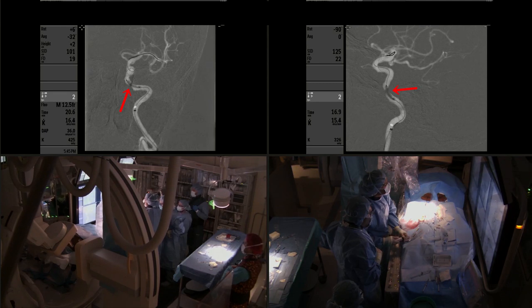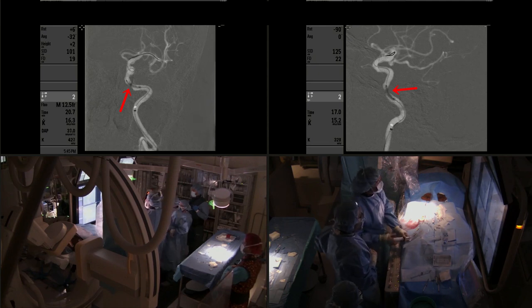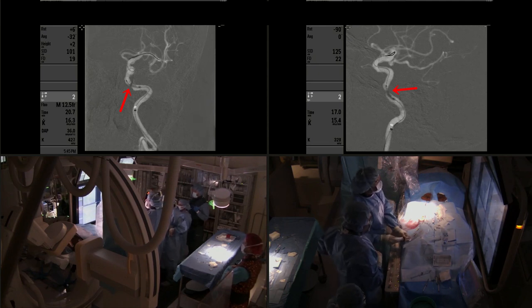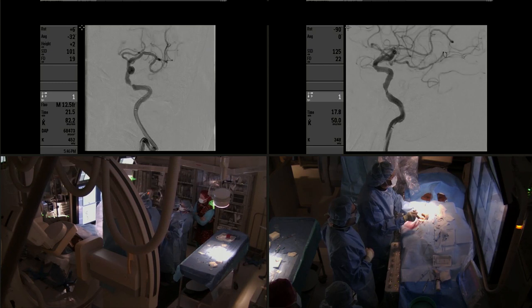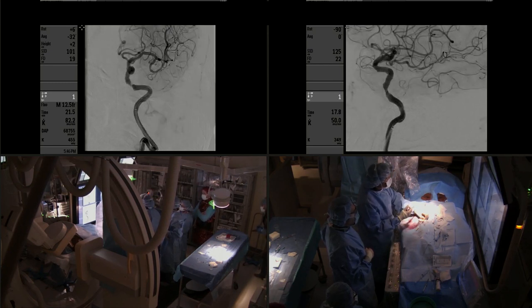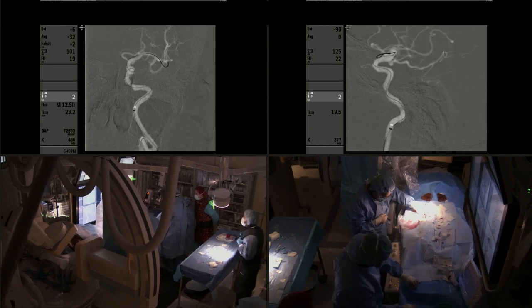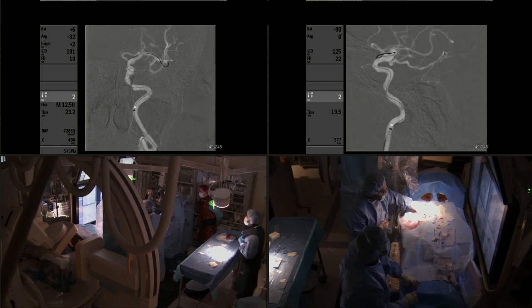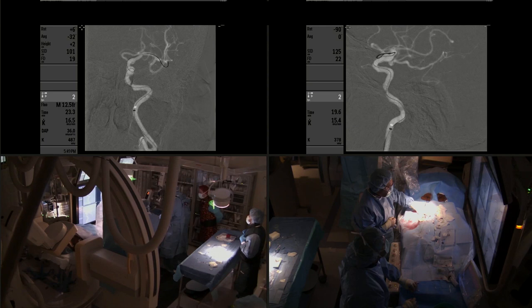We do not do the stent followed by balloon angioplasty after. We always do the balloon angioplasty before when using the stent. You can see the balloon deflating, and this is the result immediately after angioplasty — you can already see improvements in the opacification of the intracranial circulation of the left hemisphere.